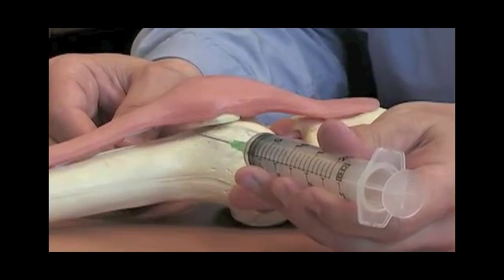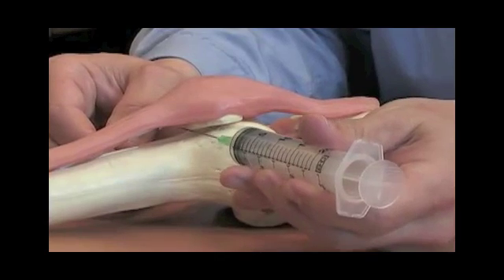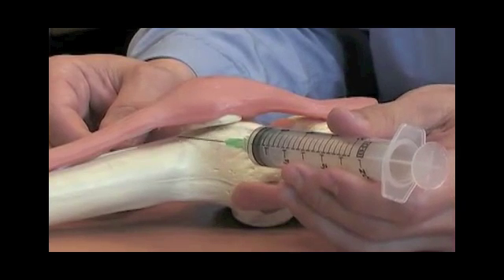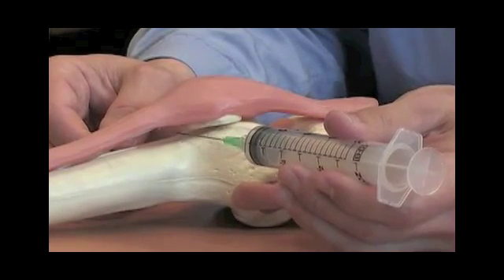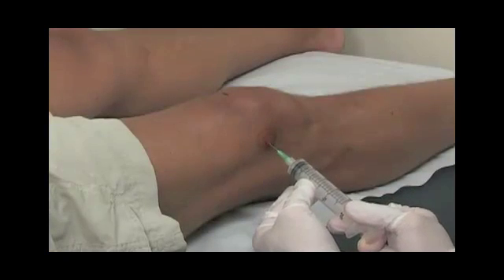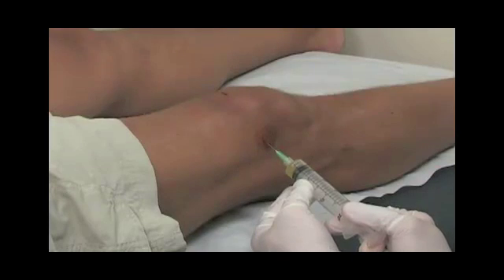I'll then take a needle on a syringe and place this right through that same exact area, penetrating the capsule of the knee joint. I'll attempt to aspirate fluid. If fluid is attained, we'll withdraw that syringe. If we're unable to achieve the aspiration of fluid from the knee joint, we'll redirect the needle and re-attempt.